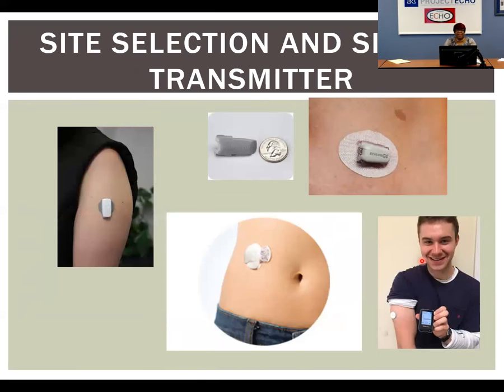And if they have personal sensors that they are going to use in pregnancy, I usually recommend thighs, because we know that that is safer. And if they're doing a whole lot of pressing and having some difficulty with insertion, we recommend thighs.